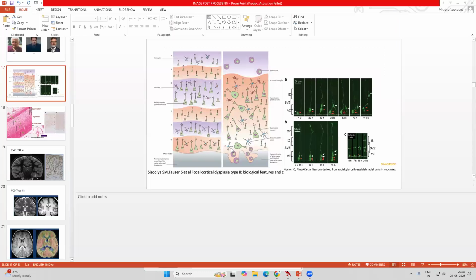It's scheduled in a way that it's always scheduled with an EEG tech to come in and monitor. We do it during the uptake phase. When the patient is being scanned, we don't. But during that one hour of uptake phase, the patient gets EEG monitoring continuously. In my experience, we do EEG 30 minutes before injection and 30 minutes after injection of FDG.